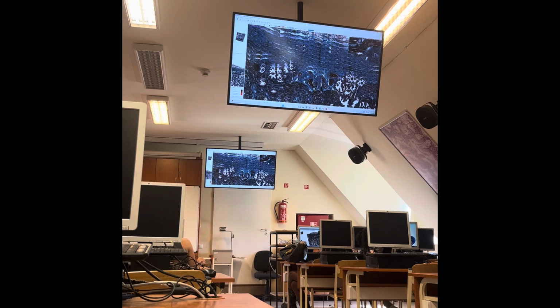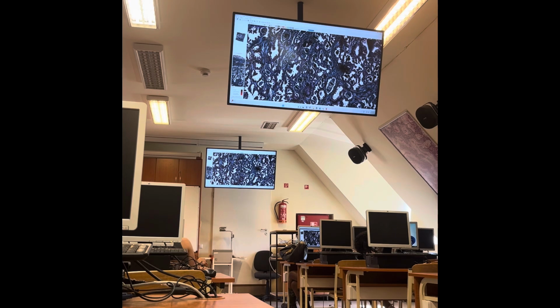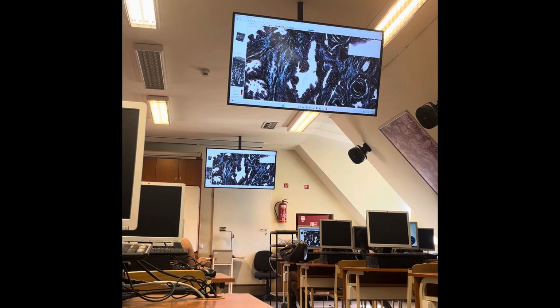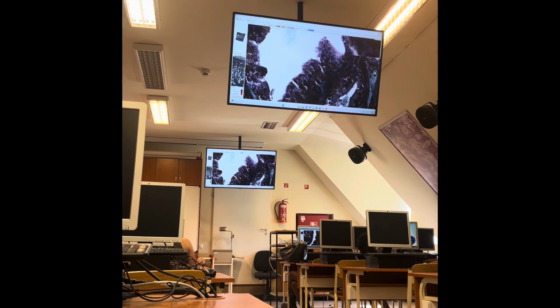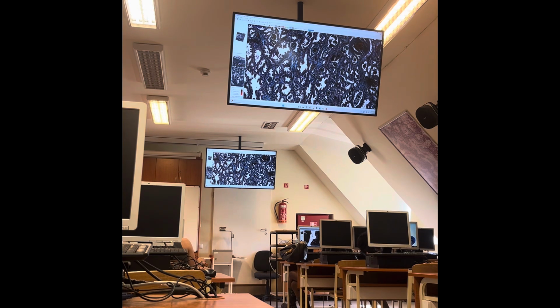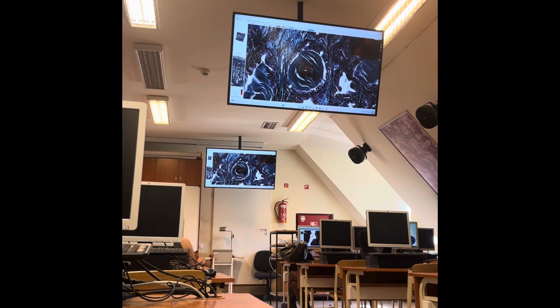Now let's see the glands. Again, we can see glands, tubular glands with irregular lumen due to the different shape and size of the lining epithelial cells. And you can see also the concretions in high number in the lumen of some of the secretory units.